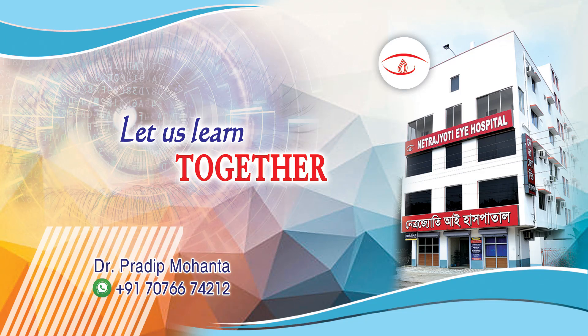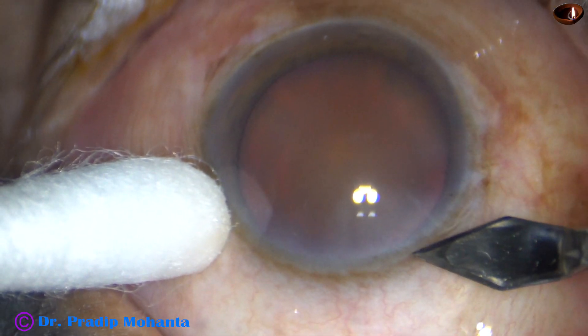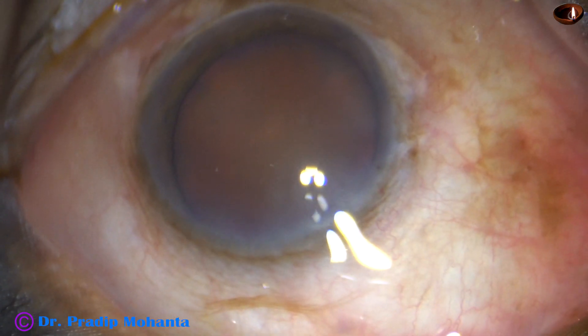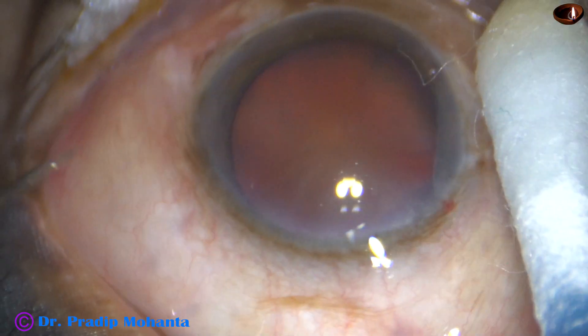Friends, welcome to my workplace at Ranaghat, West Bengal, India. This is a hard cataract with grade 5 nuclear sclerosis. In this case, the nucleus could not be divided into free fragments by direct chop. Let us see this surgery.